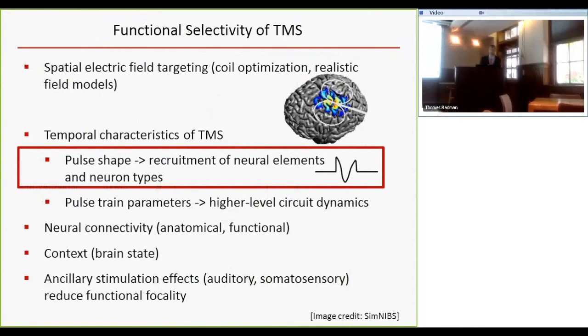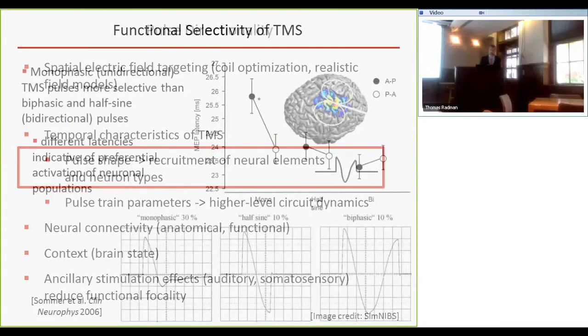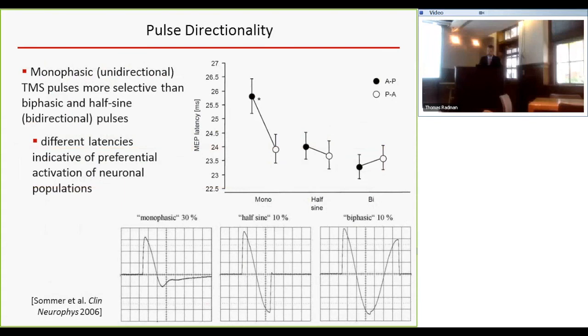First of all, for those of you with a background in TMS, you may be familiar that conventional TMS devices typically offer you one of two waveforms, or some of them offer you both. The typical waveforms are monophasic, where the pulse is a monophasic cosine pulse, and biphasic, which is again a cosine pulse that has a full period of oscillation. The biphasic pulses are the basis of essentially all repetitive TMS devices, including those used for therapeutic applications. Some devices, actually just the MagVenture devices, I think, and maybe now some other ones, also offer this half-sine pulse, which is sort of in between. There's a pulse in the negative phase.